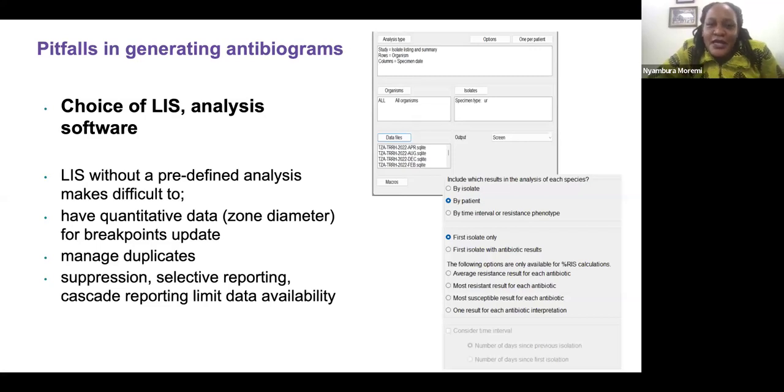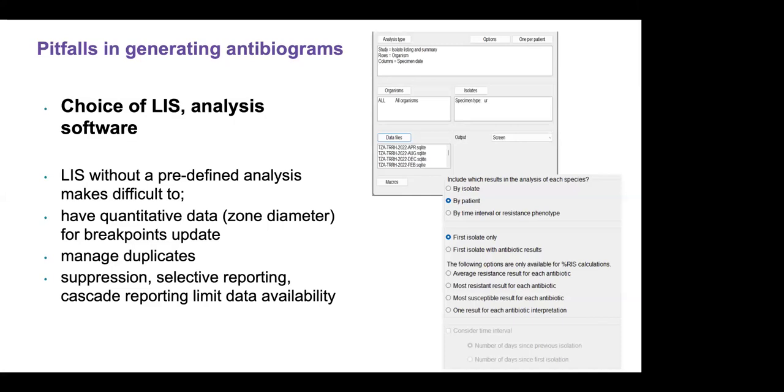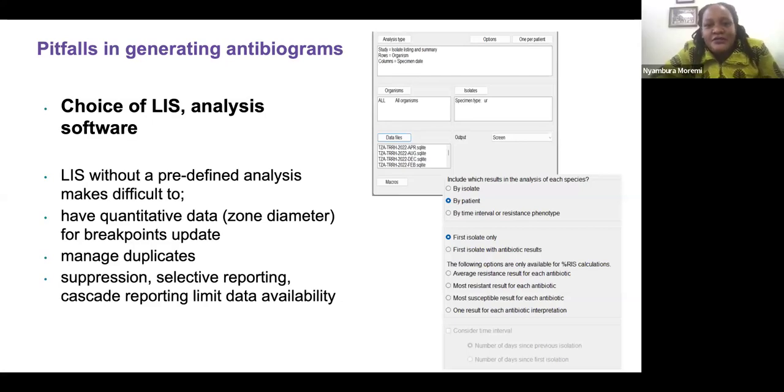But in the middle of that, maybe the CLSI, or even if you're using maybe the EUCAST guideline, they changed their breakpoints. So you might find the interpretation you had is not the one that we are intending now. And this can be dangerous to patient care, because sometimes it can lead even to mortality if you give an ineffective treatment.